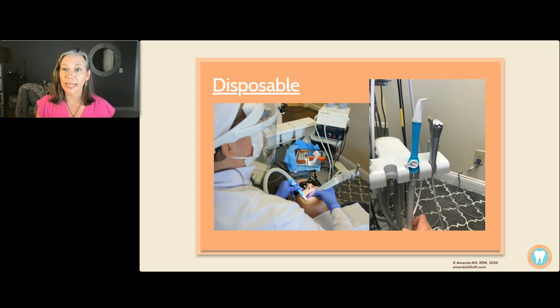All of the disposable HVEs that we use, we use one by Dove Dental. They have built-in backflow preventers too, which is great because when we think about those inline backflow preventers, at some point they're going to fail, and there's no way to know if and when they fail. And so I really like these because I know that if my patient does decide to have a makeout session with Mr. Thirsty, the slow speed suction, I know that there's a backflow preventer in there that's keeping them safe.